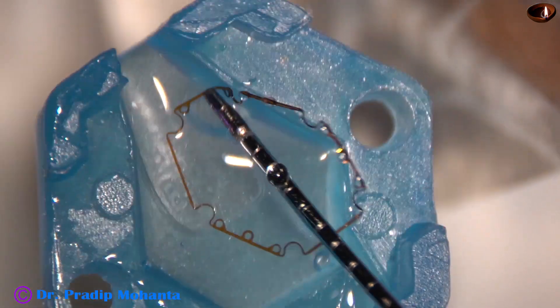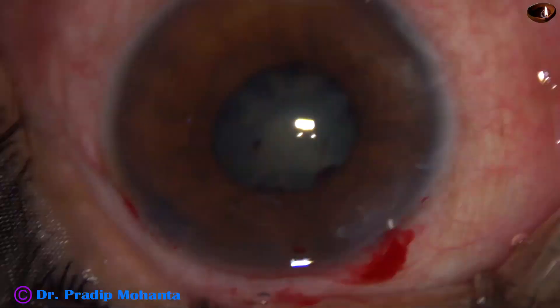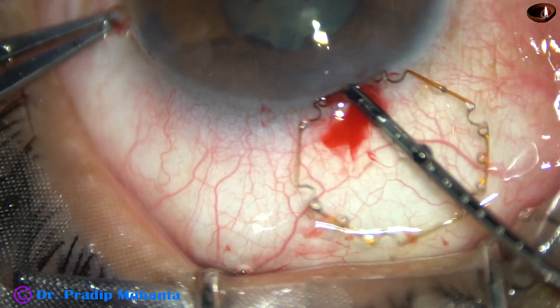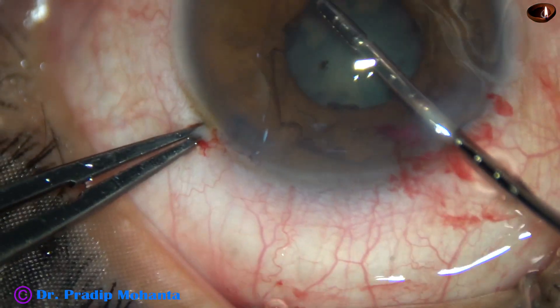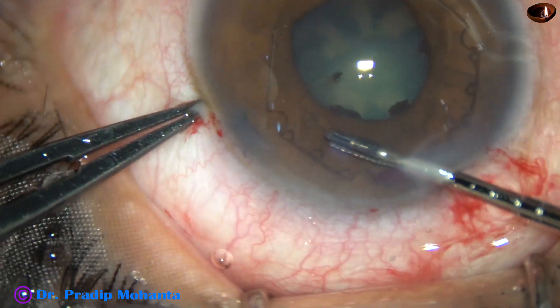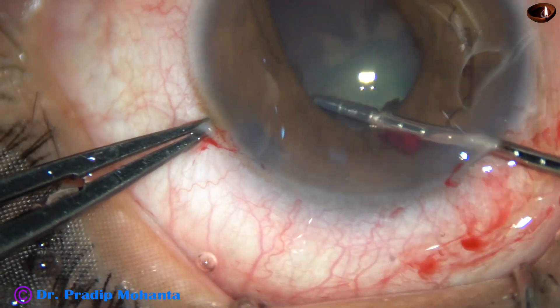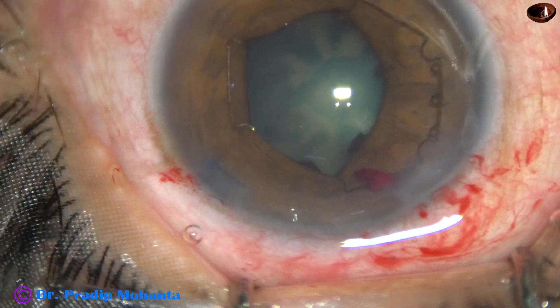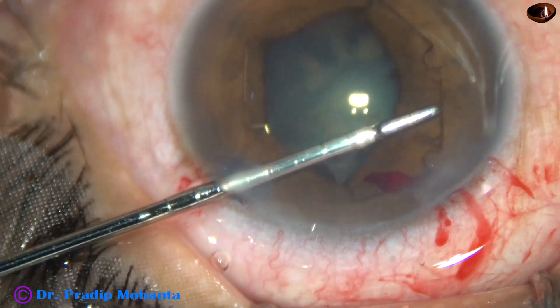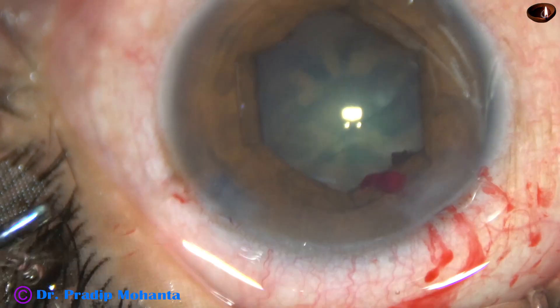This is a very thin, uniplanar device with flanges and notches. Alternate flanges will go behind the iris. The device is taken completely into the anterior chamber by the B-hex forceps. The leading flange is tucked behind the iris. The flange at one o'clock is held and also tucked. Going through the left side port, I hold the middle tab of the flange at 10 o'clock and tuck it. And the B-hex is applied.